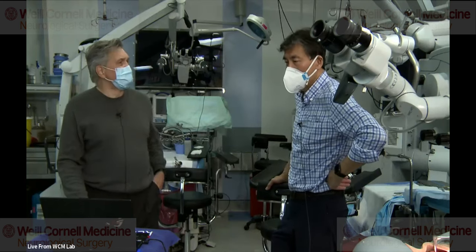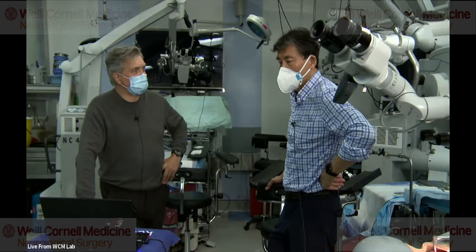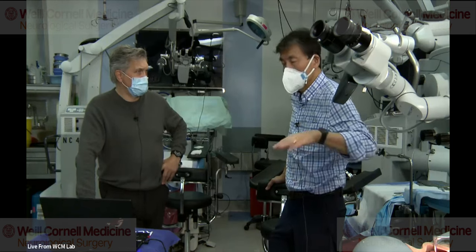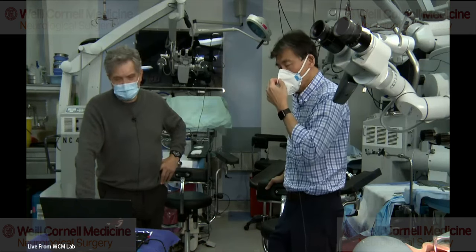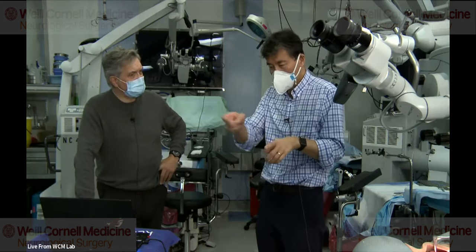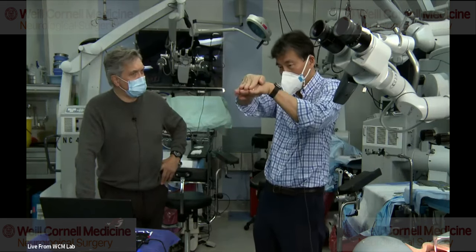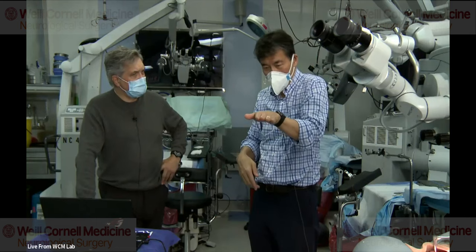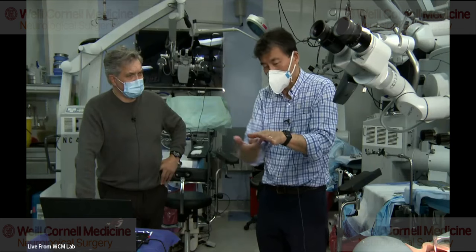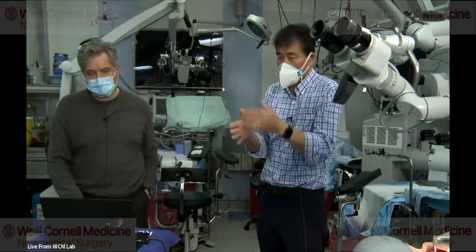The seromas are deep, and that's because there's a dead space. I've not seen a seroma in the subcutaneous tissue because we obliterate any space between the lamina and up by putting so many sutures in. You don't want any space. When you close the wound, you don't want to just close each layer, because then you have a layer here, a layer there, and an empty space. What I do is bite on this side, then bite the bottom, and when I bring it up and close it, it's tacked to the layer below. By doing that, there's no dead space.